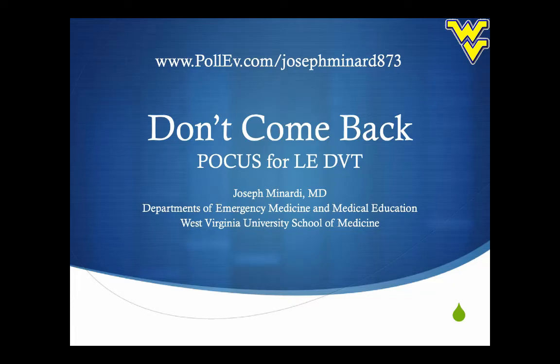I think you can see where I'm going with this. Don't come back. Ultrasound for lower extremity DVT. Just a quick little thing. So I had a case like this. I feel like I see these a lot.